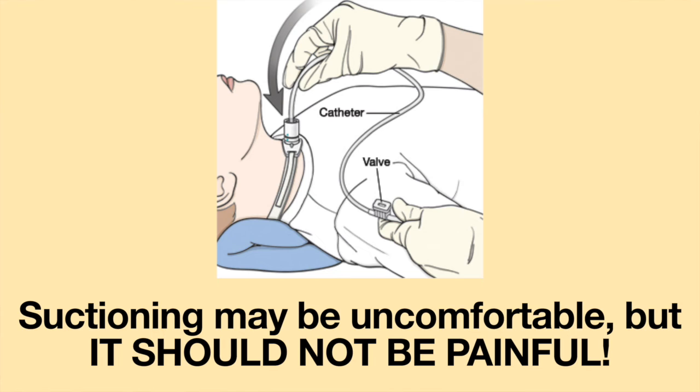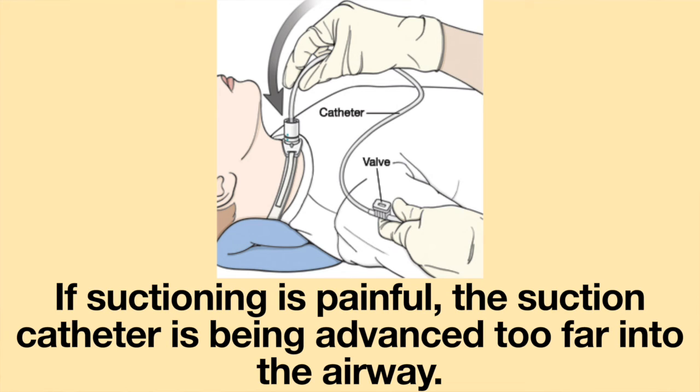Several YouTube viewers have written me telling me about horrible experiences their family members endured while being suctioned. They told me how their family members cried and their bodies violently jerked while being suctioned. Folks, this should not happen. Suctioning may be uncomfortable, but it should not be painful. If suctioning is painful, the suction catheter is being advanced too far into the airway. Please ask the medical staff to perform shallow suctioning.